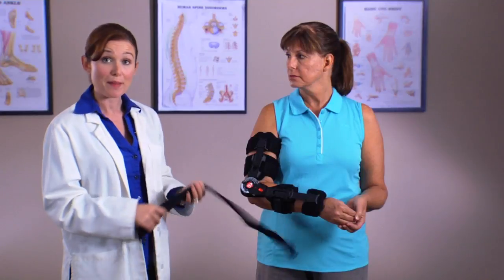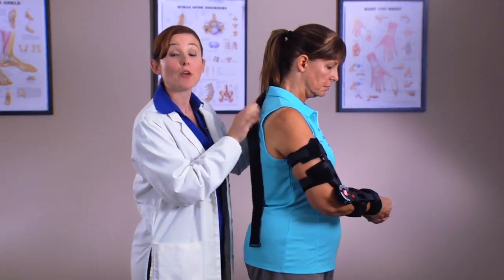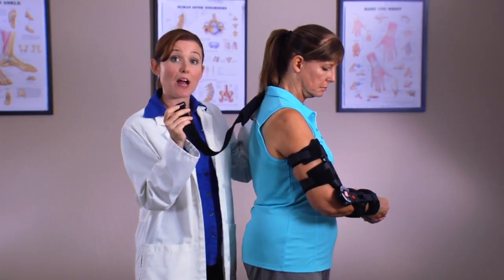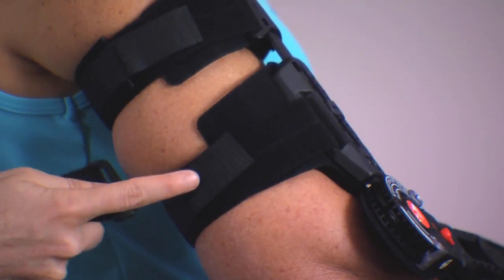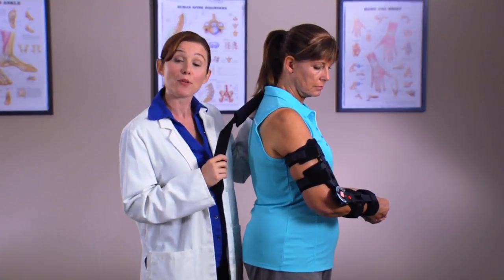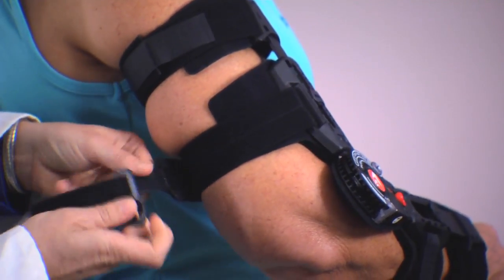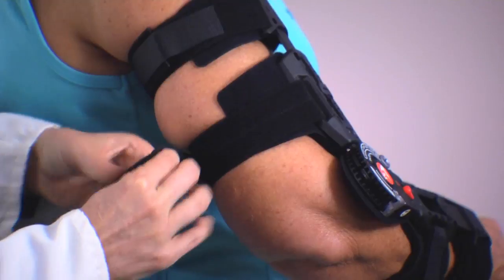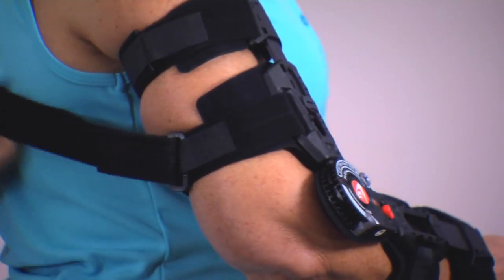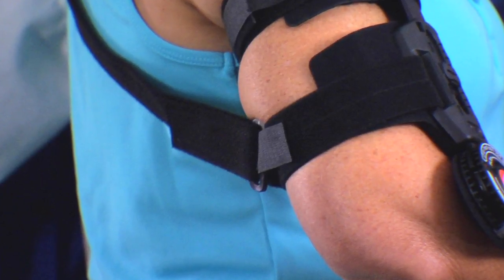Now we'll apply the shoulder strap. Position it over the patient's shoulder with the strap pad located behind the neck. The D-ring on each end of the shoulder strap will attach to the upper arm strap closest to the hinge and the forearm strap closest to the hand. Attach the upper arm strap by sliding the alligator tab at the end of the strap through the D-ring on the end of the shoulder strap. Pull the strap completely through the D-ring and fasten firmly. The D-ring on the shoulder strap should be properly positioned behind the arm to support the arm.